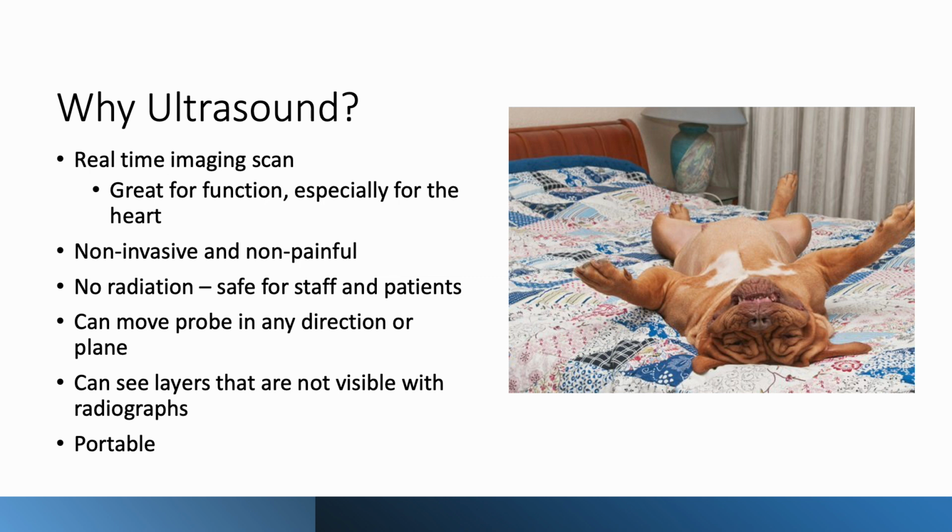Ultrasound is a wonderful modality, and there's some benefits to using it. It's real-time imaging. We get a picture of what's going on in that exact moment. And it's great for function, especially for the heart. It's non-invasive, it's non-painful, there's no radiation, so it's totally safe for the technicians and for the patients.